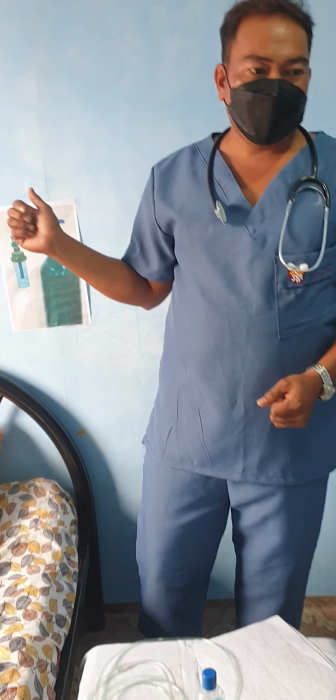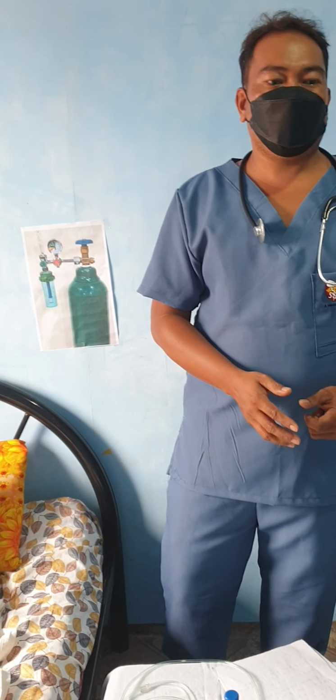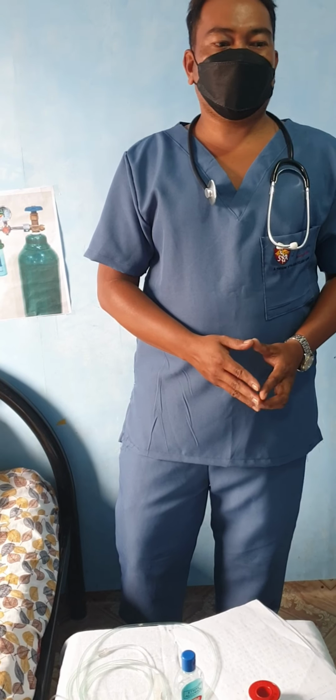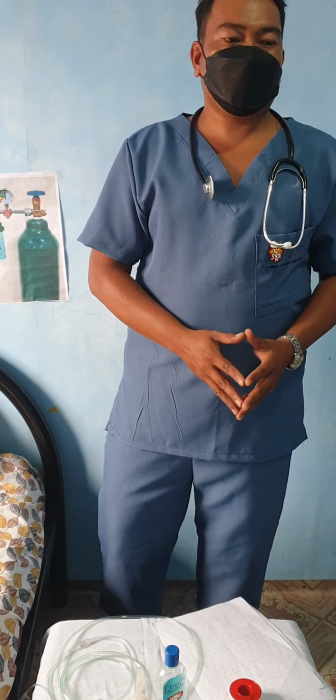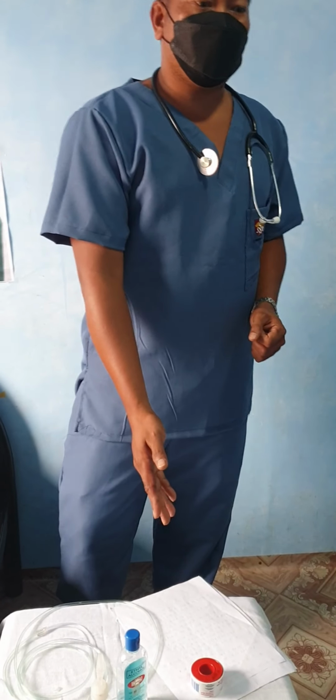The articles and equipment that we need are: a client chart, an oxygen connector tube, flow meter, humidifier filled with sterile water, oxygen source, wall outlet or the oxygen cylinder, tray with a nasal cannula of the appropriate size or oxygen mask, kidney tray, adhesive tape, scissors, and oxygen stand.